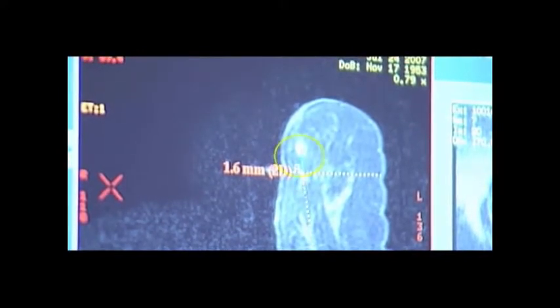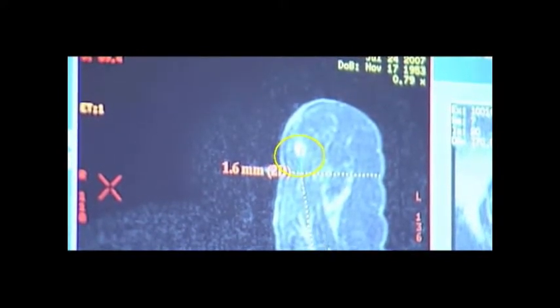While still at the lesion image, use the measuring tool to draw a vertical line from the center of the lesion to the guideline previously established. This is the Y value and will be the distance the pillar will move in the vertical direction. Record this value.